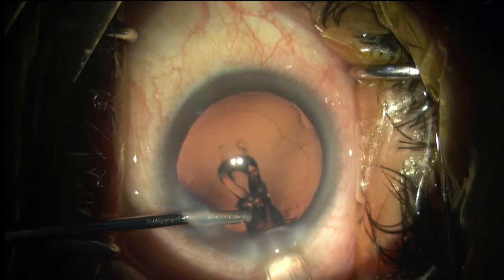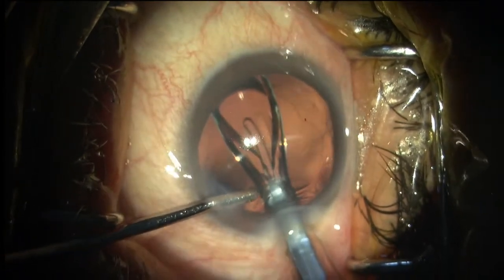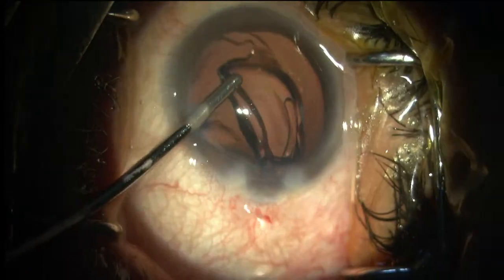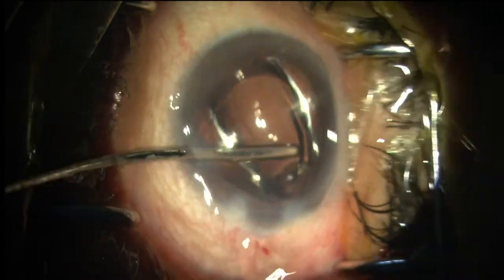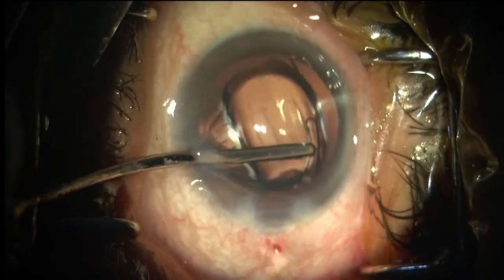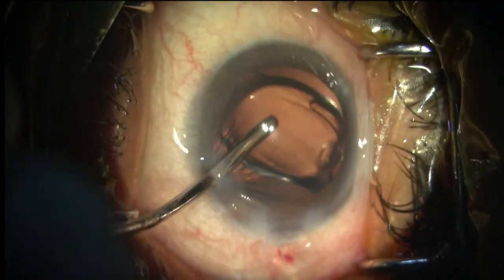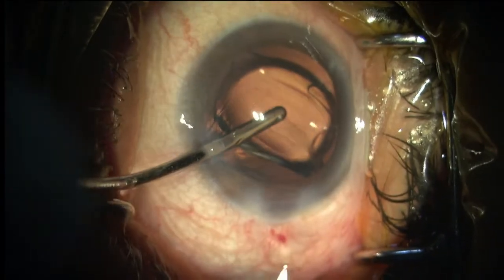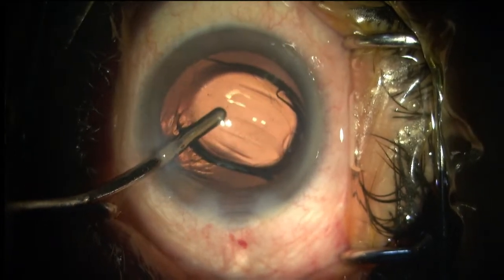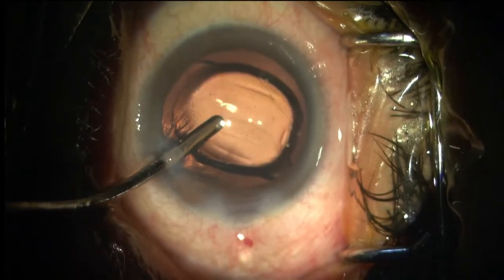Infusion cannula. I'm giving counter pressure. You can see I have positioned the lens in an axis where the rhexis was large, so that the optic is still covered, though the rhexis is slightly larger on the superior temporal side.